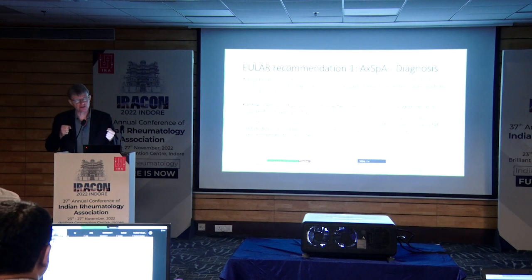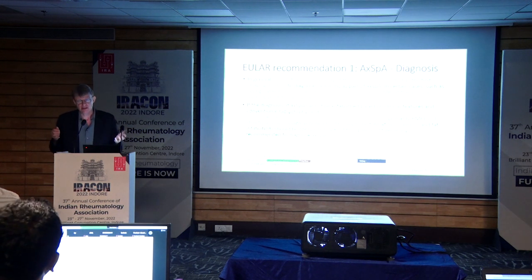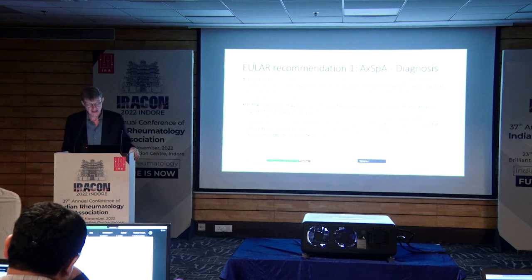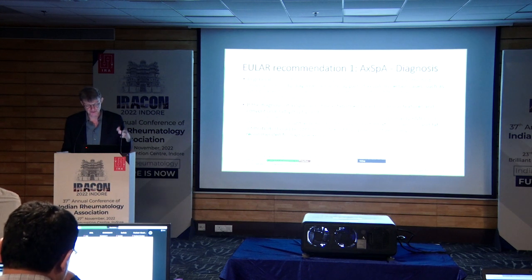But if you're not certain that the patient has SPA based on that, and you say, okay, there's nothing to see, then it's not correct in my mind to say, well, then you don't have axial SPA because there's nothing to see in X-rays. You would need an MRI to say that there's no changes, given that you have the clinical suspicion. And that's what it also says here, and that you should look both for inflammation and damage here, inflammatory lesions and structural lesions, like erosions. So that's the clinical practice part.